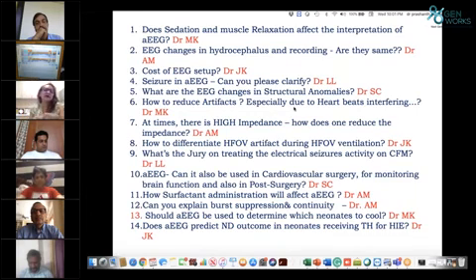And then artifacts can occur when the two electrodes are placed quite near to each other, or they get displaced. So you should have a proper measurement where you know the distance is well maintained, so that the artifact is less. And then the ECG, with the pulse, there might be an artifact because of that.